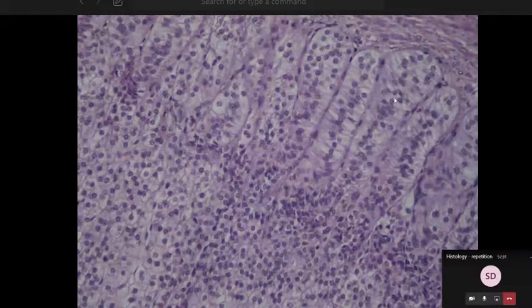From the higher magnification, we can see some connective tissue elements from the capsule. This is the zona glomerulosa, and the endocrine cells here are arranged in arches and spherical clusters with numerous sinusoidal capillaries. So each cluster is surrounded by a capillary. Okay, these are the endocrine cells, and these are the capillaries. Then you have this zone with the stem cells, and then you have the most extended zone.